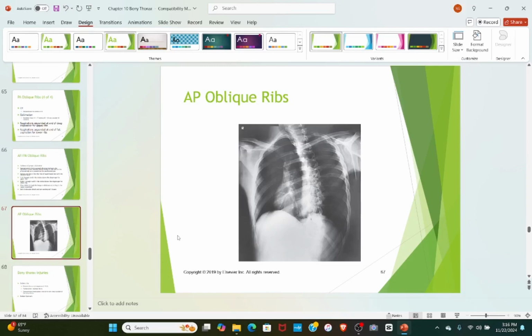So this is an oblique of the ribs. What we're looking at here, this is right. So if this is AP, that's an RPO position, AP projection, and these ribs over here just don't matter, really, fundamentally, on this particular image. Look at the difference in the ribs and how long they look. So primarily what we're going to be seeing is posterior ribs, and then also the axillary portion of the ribs as well. Primarily what the obliques are for is the axillary portion of the ribs.